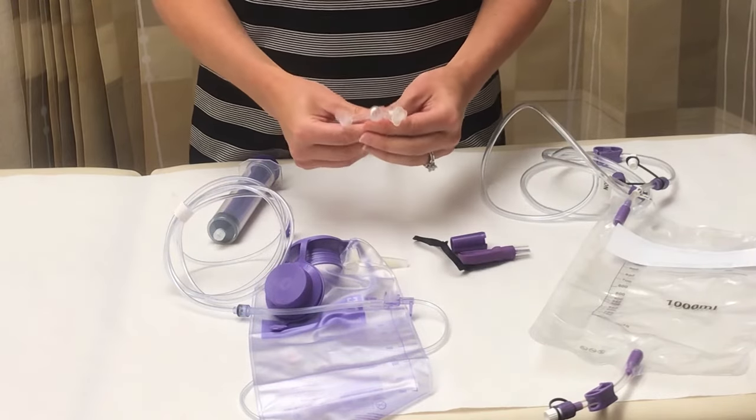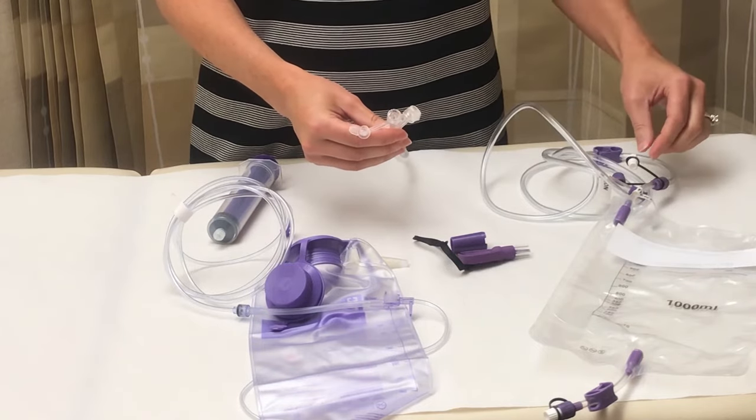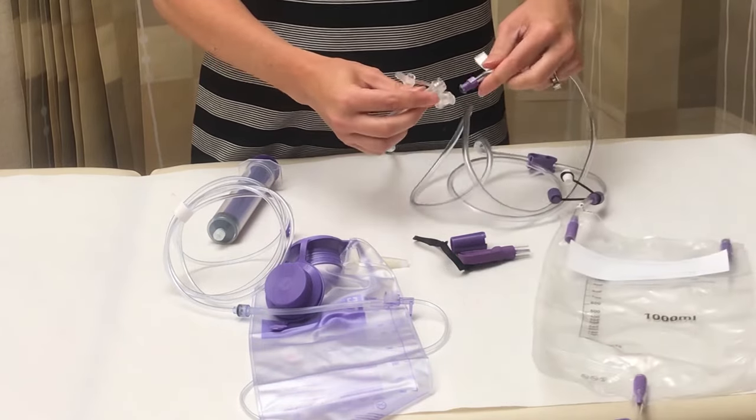Lastly, if you use your tube for venting, you'll need an enteral drainage bag. This screws onto the end of your feeding tube as well.